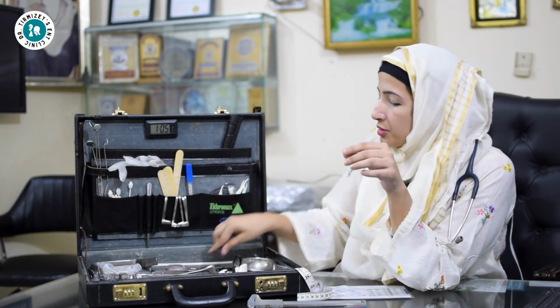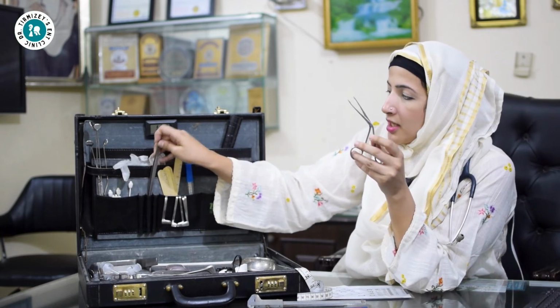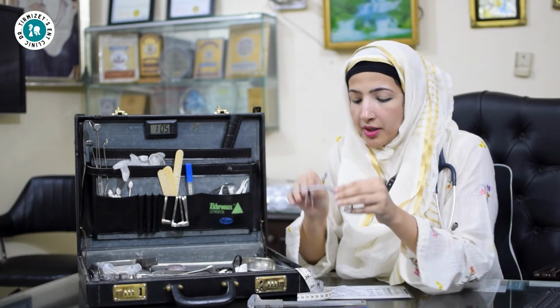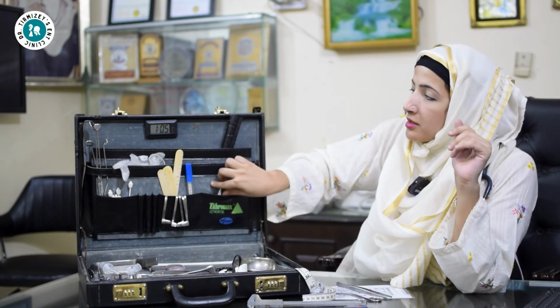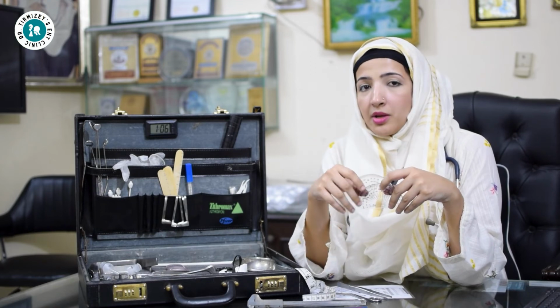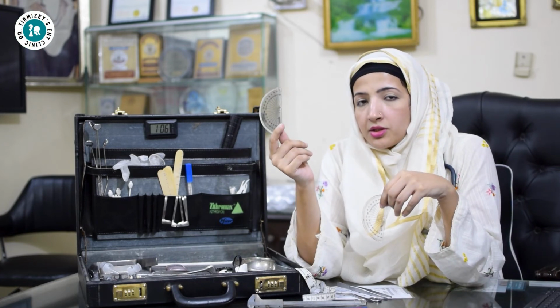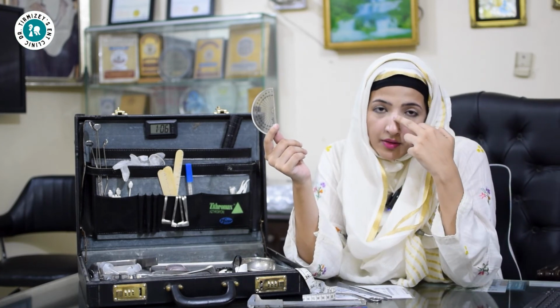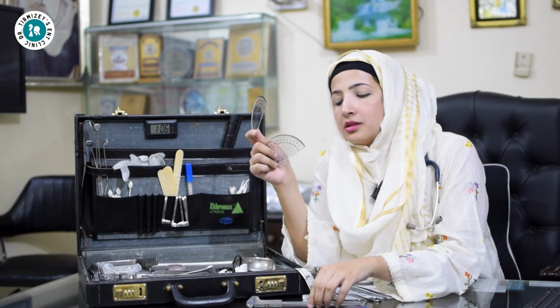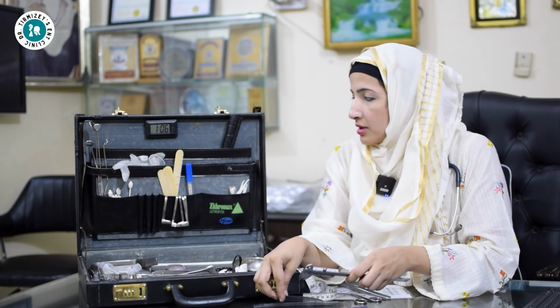Again, as sir have already told you, you need forceps with you in case you accidentally leave behind any residue. Alright. Then sometimes a patient is presented to you and they say that the patient is a case of rhinoplasty. So in that rare occasion, which is very rare, I also have these. So I can measure the angle of this and the nose angle and the rotation and the projection. I have this and scales and vernier caliper for any case, in case I get a rhinoplasty patient.